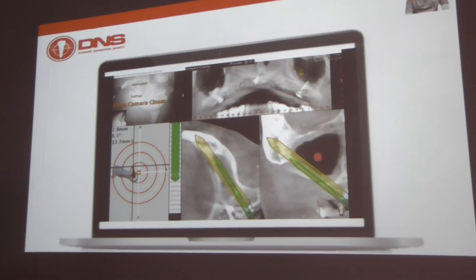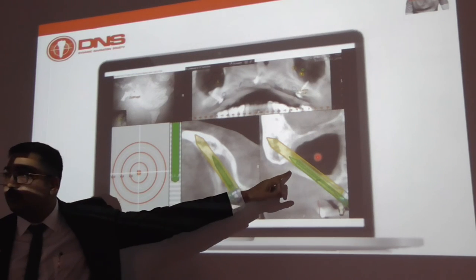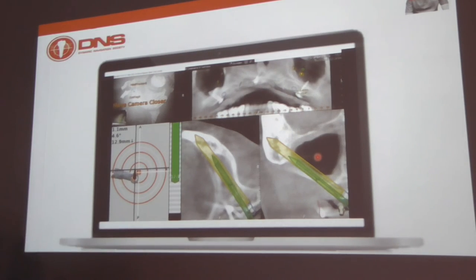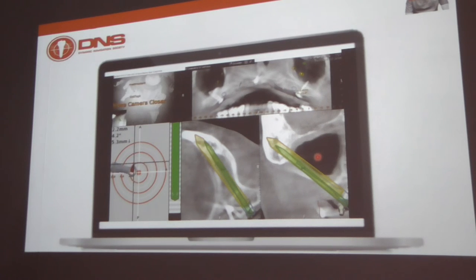So this is a video of me drilling. This part is the easy part, soft bone. Once I enter here is where I feel the resistance. If you'll notice, I'm not drilling fully, I'm just sort of tapping. A piezo would again be a better option for coolant as well as less trauma. So finally, this is the amount of time you need to place a zygoma. By clock, 5 minutes, because you just have to drill once, or twice if there is too much dense bone. That's it.